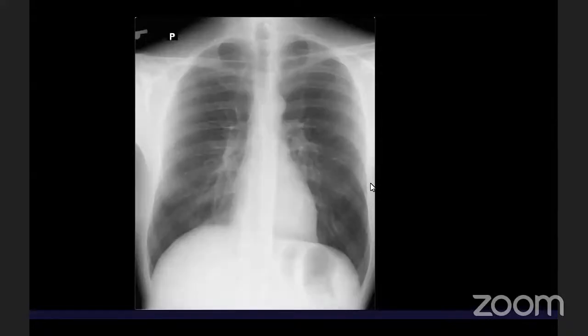I will show you a normal, nice, healthy chest X-ray. When we start, you can see there is a slight rotation, because looking at the clavicle, the spinal process is not in the middle, but inspiration is fine, and penetration is fine. So let's start. Lung fields are normal, symmetrical, no shadows, nothing wrong there. The hilum on the right is here, slightly lower than the left one, which is nice. They are transparent and concave. The heart is not enlarged and there are no shadows in the heart shadow. No other shadows. The mediastinum is not dilated.